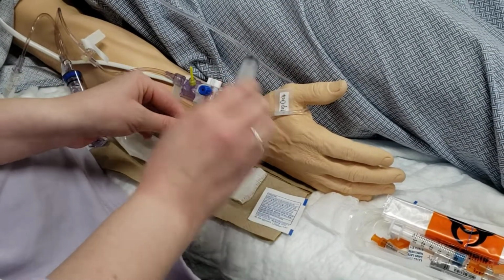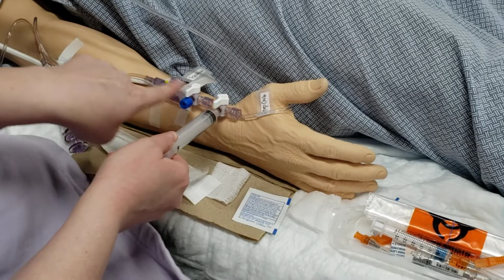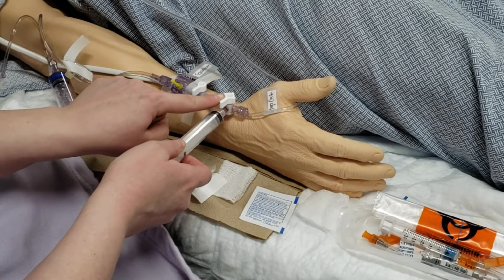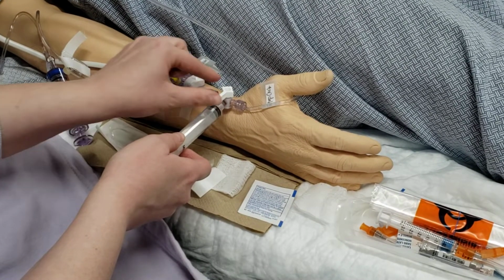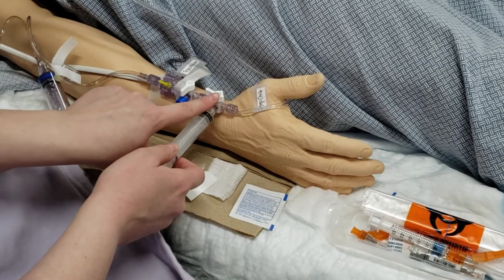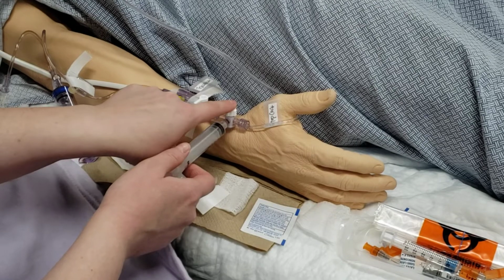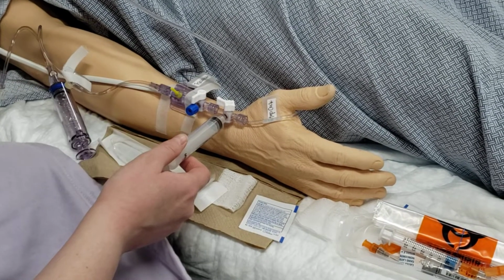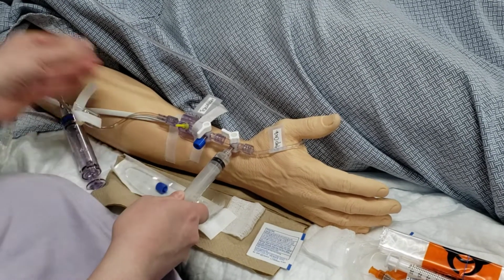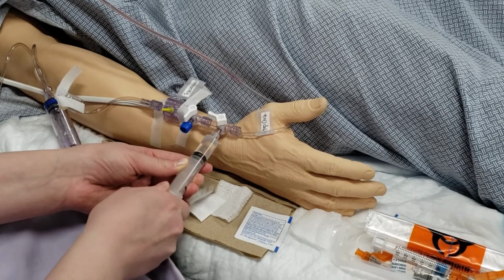I'll take my syringe, place it on my stopcock, turn off towards my line. With the stopcock, wherever it's pointing is considered off. So we can turn it off towards our line. I just remember any time it's pointed towards my little pigtail is my line. So we first want to point towards my little pigtail or towards my fluid. Then we want to pull back because we want to get blood back.